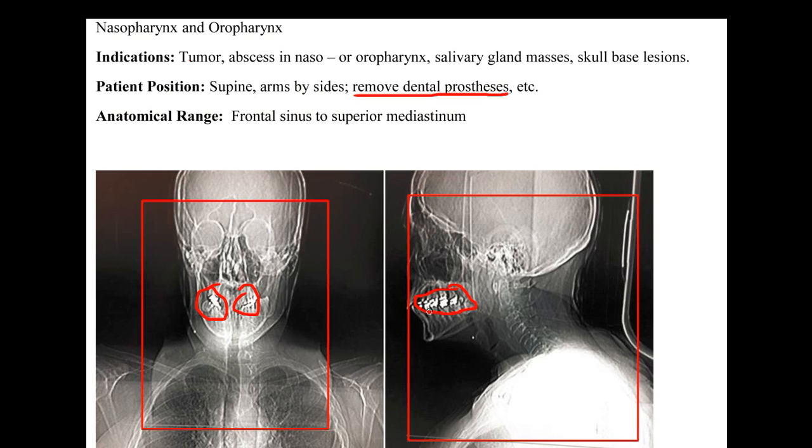And as we can see, this would kind of fit in the level of C1 and C2. Here is C2 with the odontoid process. And so if you'll notice, it's almost in the same plane. So this can be very detrimental to diagnosing the patient.